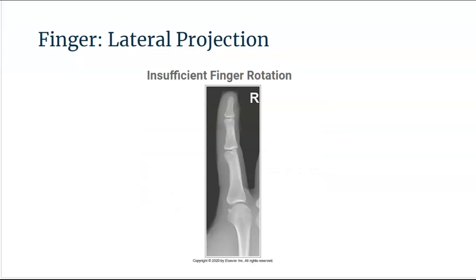For insufficient finger rotation in the lateral projection, the finger will present more like a PA projection with soft tissue nearly equal on both sides. I typically look at the metacarpal heads to determine rotation: if the digit being imaged appears anterior to the others, I know I am excessively rotated; if it appears posterior to the other digits, I know I am under-rotated. Look at all the anatomy as a whole.